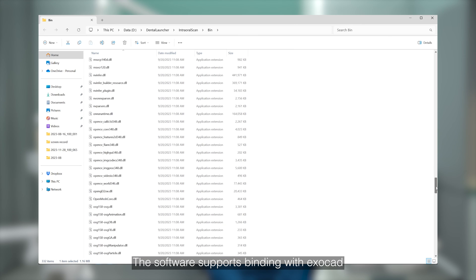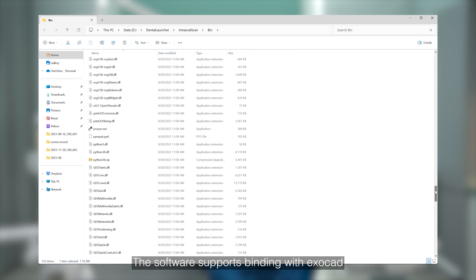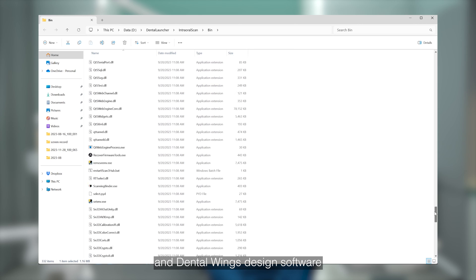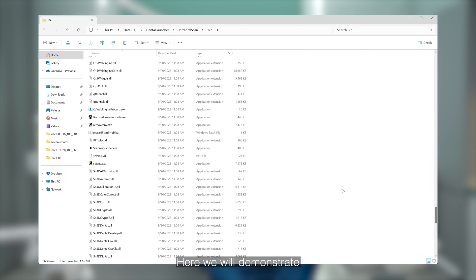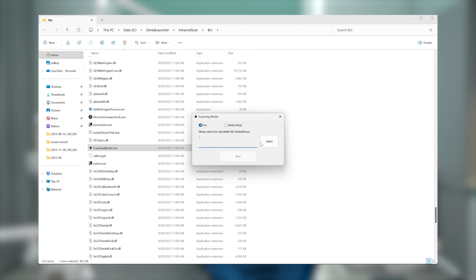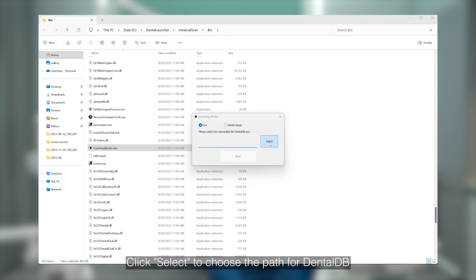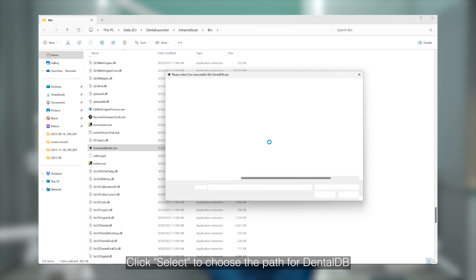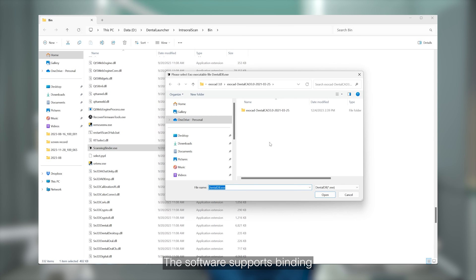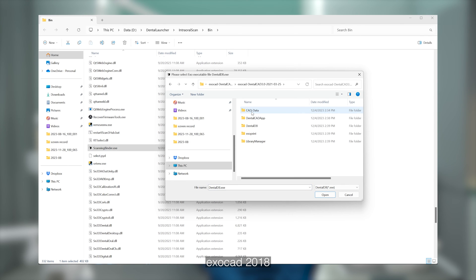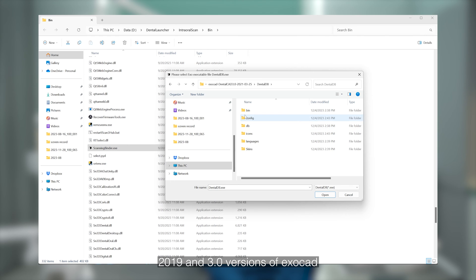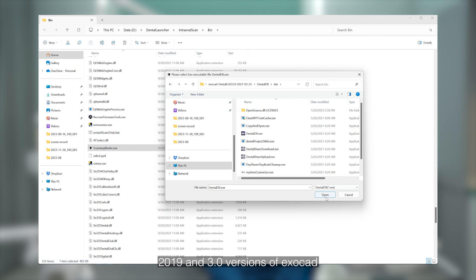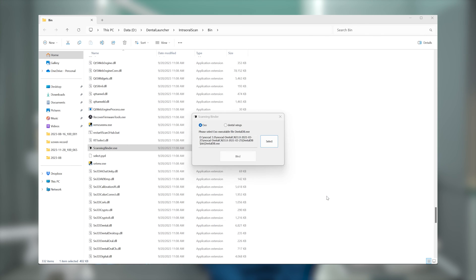The software supports binding with ExoCAD and DentalWin's design software. Here we will demonstrate the binding process with ExoCAD. Click Select to choose the path of DentalDB. The software supports binding ChairSide 2.1, ExoCAD 2018, 2019, and 3.0 versions of ExoCAD.